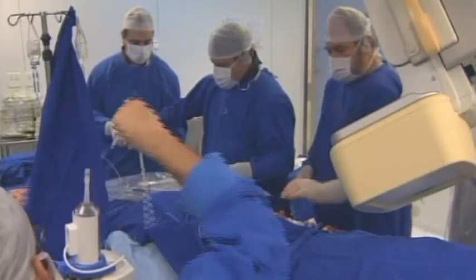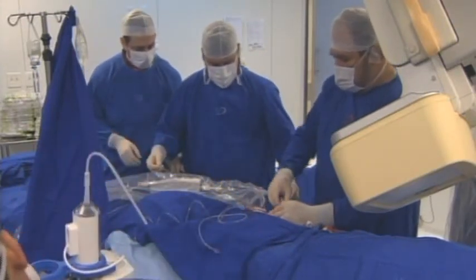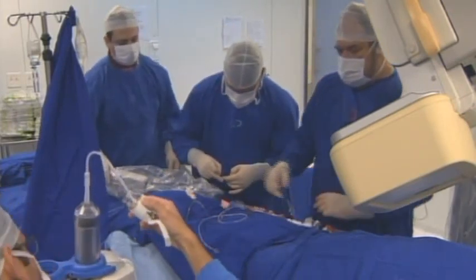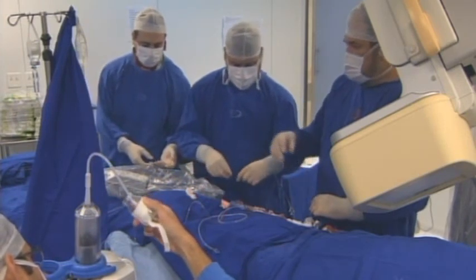Same outcome. That's interesting. If you do it smart, obviously, if you have a diabetic with a long lesion in a small vessel, you're going to put in a drug-eluting stent. But if in the same patient you have a very focal lesion, you don't have to. Like this case in the right, you could have picked only a short stent. I have to change my mind for that.